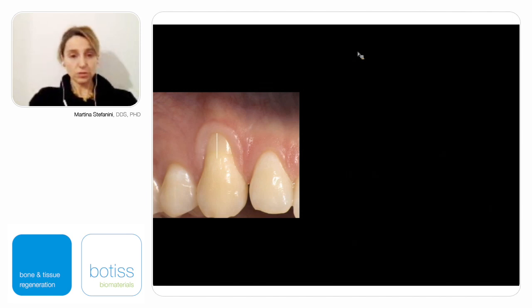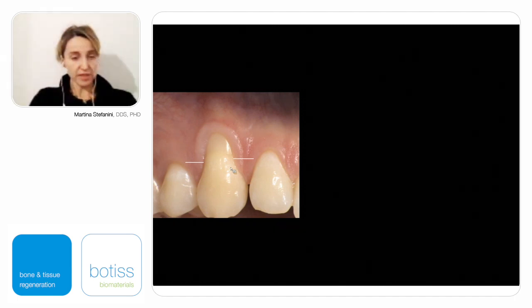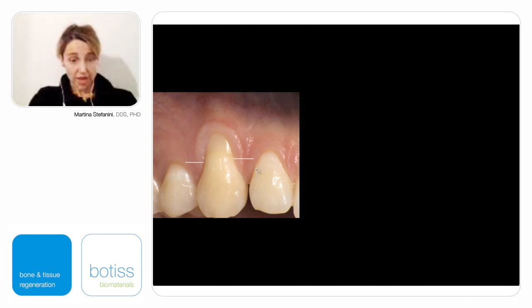This dimension should be positioned starting from the tip of the mesial and distal anatomical papilla, and at this level a 2-3 millimeter horizontal incision should be traced, and at the end of this 2-3 millimeter horizontal incision, 2 vertical releasing incisions that will reach the alveolar mucosa.